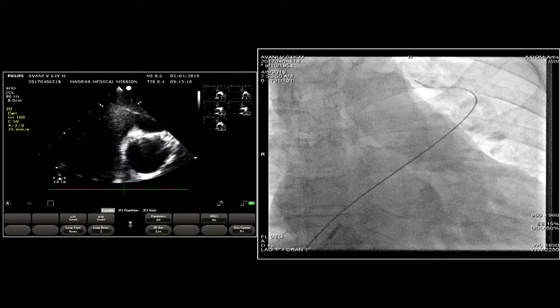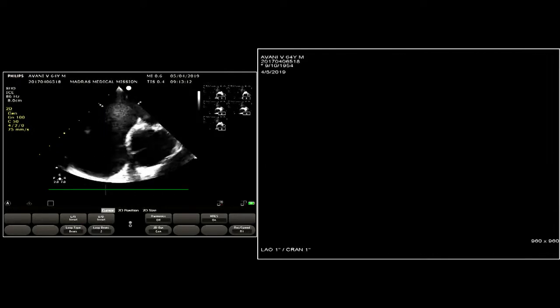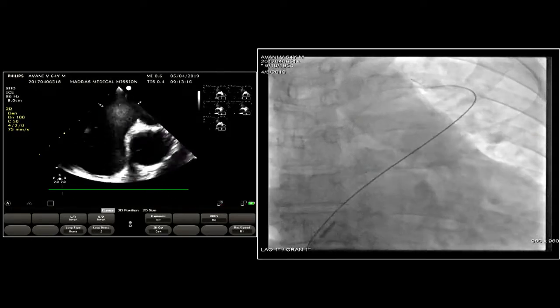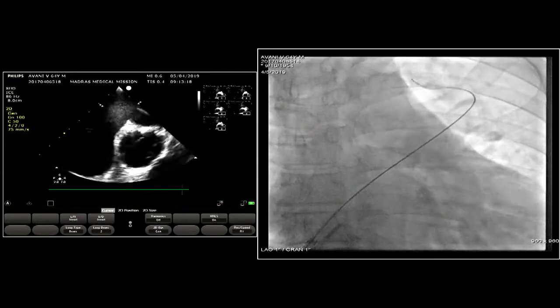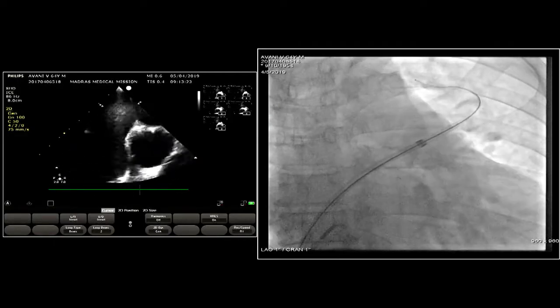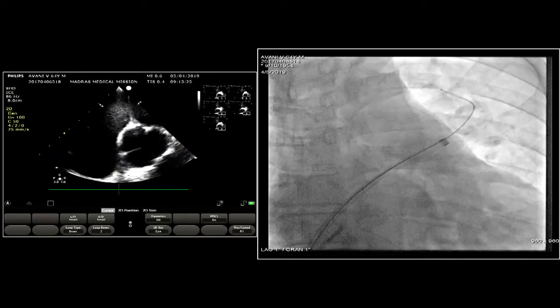Yeah, I agree with all of that. I guess I was just pointing out, you do have elevated PA pressures here, but in these patients who have a lot of left to right shunt, you often find the PVRI is very low. And so when I see a really good left to right shunt, I feel much happier.